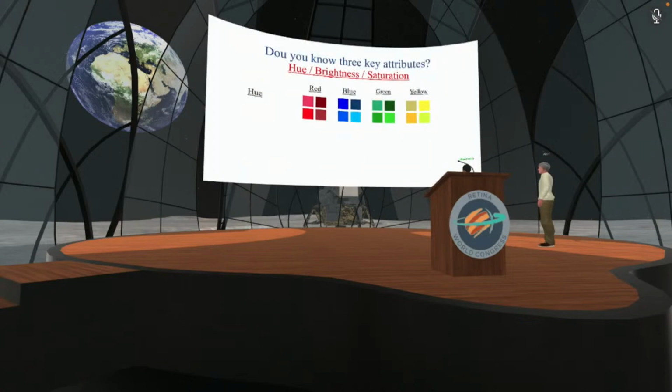I think to decrease the saturation is important for this technique. So I want to explain why it is effective to decrease the saturation. Before that, we should understand that each color has its own appearance based on three key attributes: hue, brightness, and saturation. So when you are describing a color, it is important to use all three of these attributes to accurately identify the color.